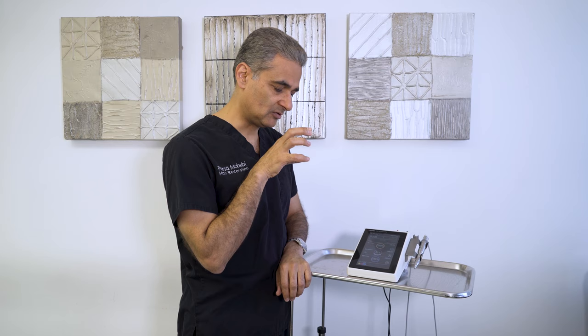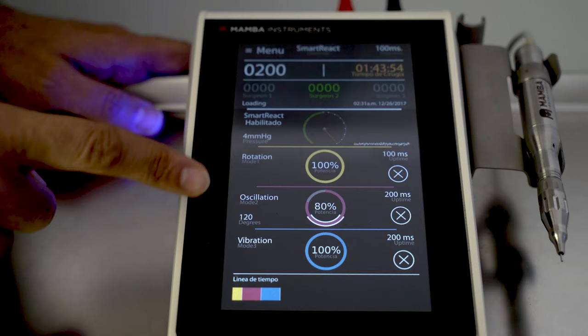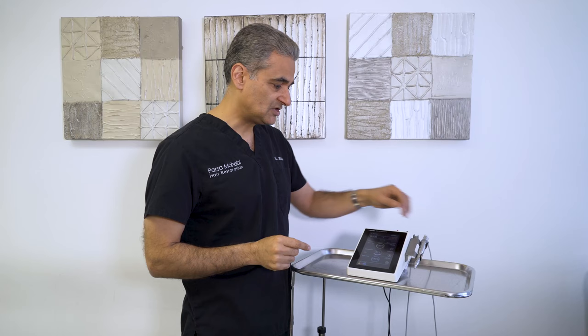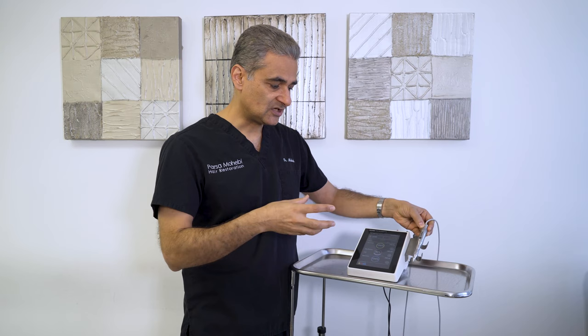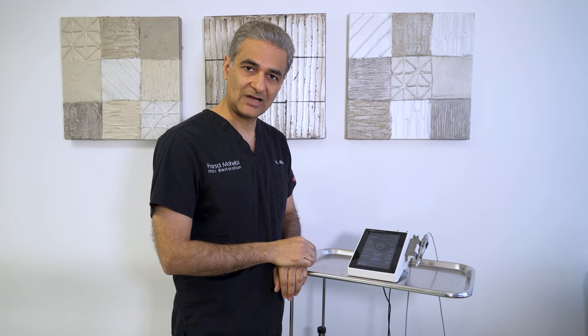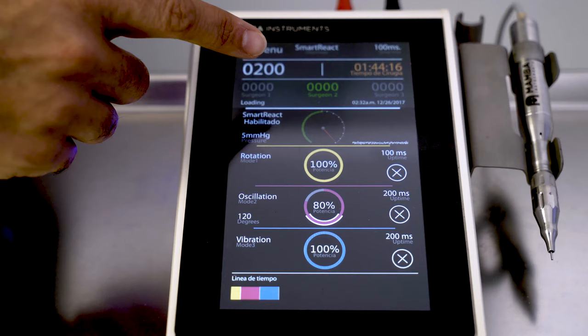When I start the machine, it cuts through the more superficial layers with rotation, then oscillation, and finally vibration. The machine has a handpiece equipped with a suction device. As you cut through the skin, the suction can pull the graft in, so you can adjust the angle of the graft and help ensure better quality grafts.